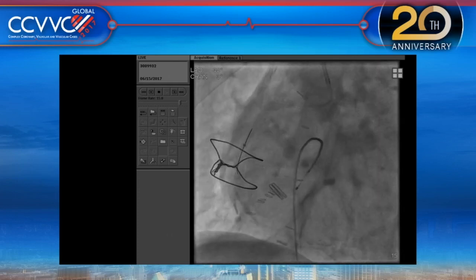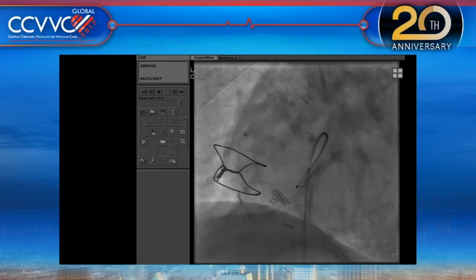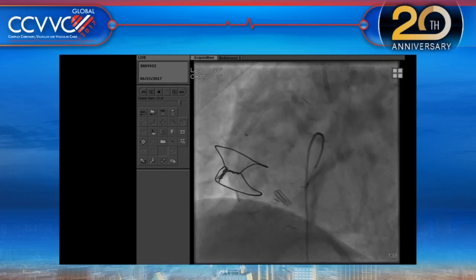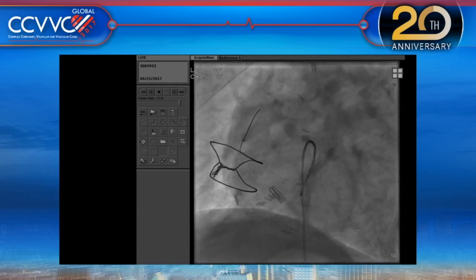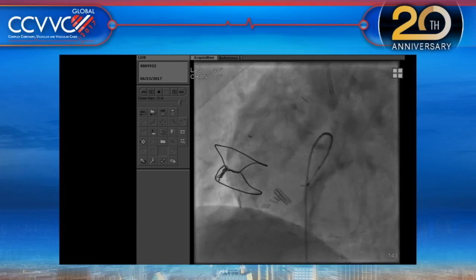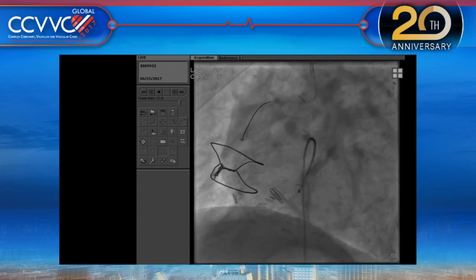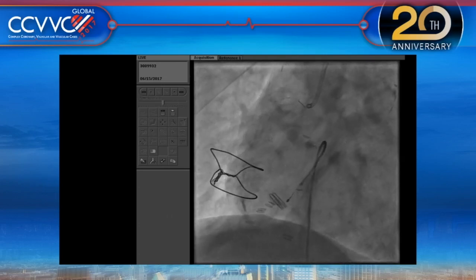So can you advance the OA burr through it? Apparently they could see it outside, in vitro, without any problem. But inside you can see here that we tried to advance. The wire is still okay. Everything started coming down. So that's where we are now, back to square one, or time zero from a few hours ago, and we have to go back through this whole process once again.